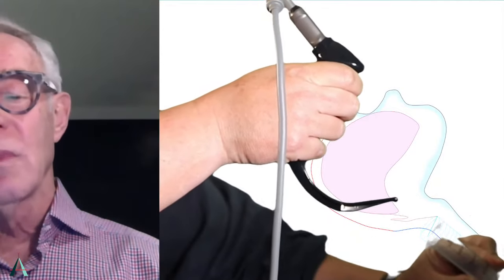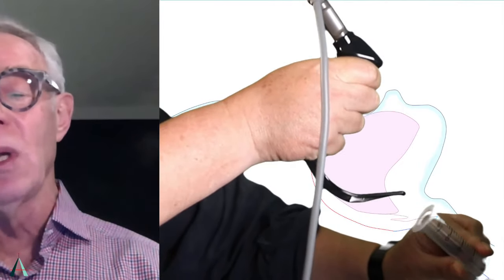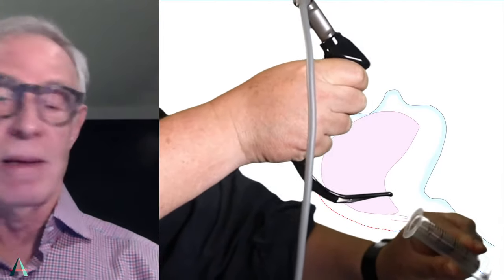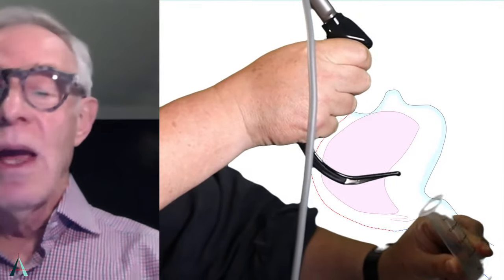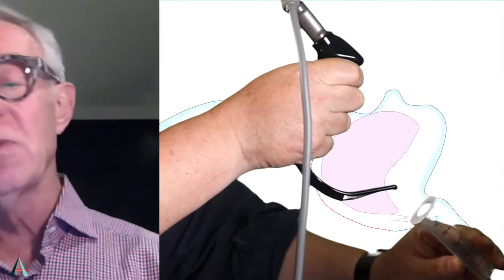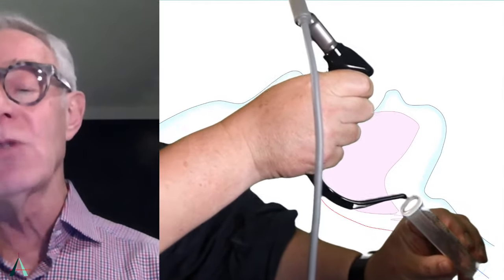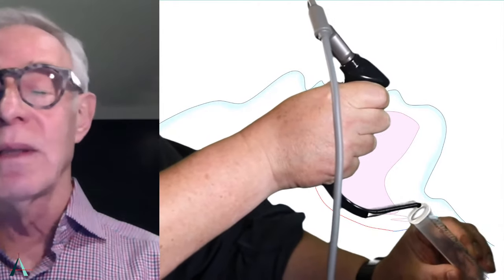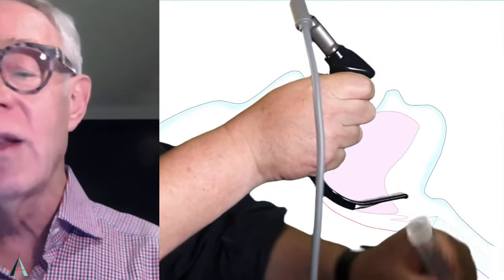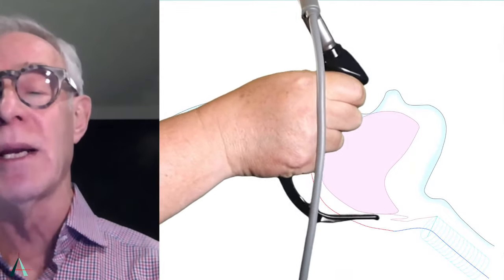All right, so that's great. So that would be before you deeply... So you're saying as I lift, the trachea is doing this as well. Exactly. And you'll get a great view of the larynx and even the proximal trachea, but that makes directing the tube that much more challenging. So now let's correct the view, or the way we would use the hyperangulated blade.